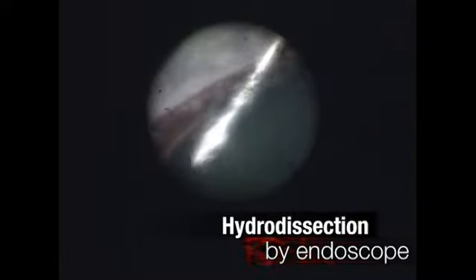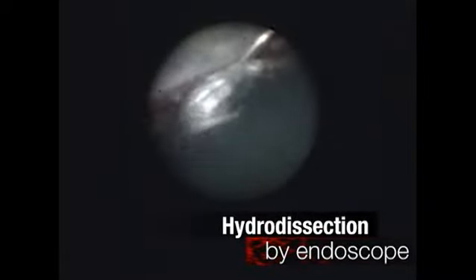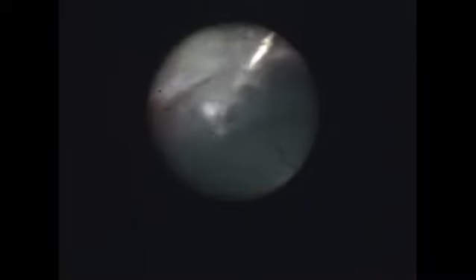Another advantage is that it dispenses with the need for red reflex, thereby offering a solution in cases of hypermature cataract, making it unnecessary to use stains. Hydrodissection may be performed. However, this may hamper perception of the wave of liquid reaching the posterior portion and may cause the epinucleus to rise and obscure the field of vision.